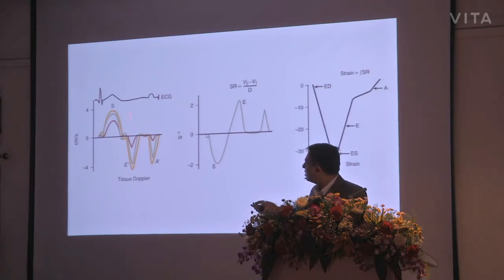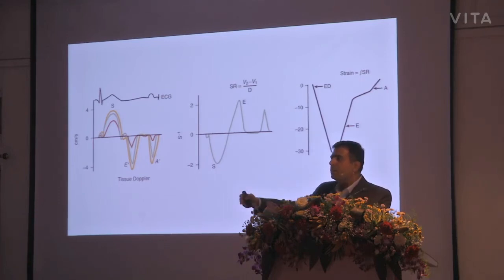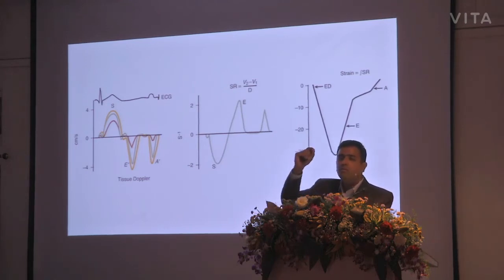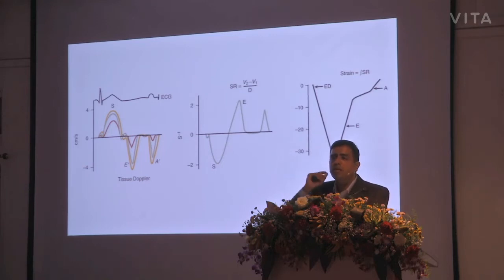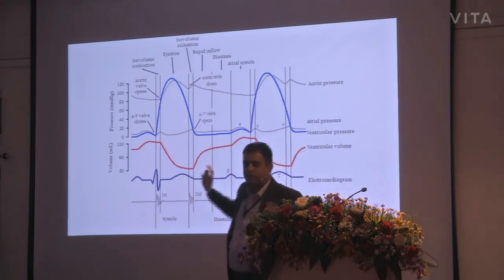The first one, the S curve is positive over here, the S curve is negative, so the systolic curve and the diastolic curves are negative where the others are positive. The strain curve, however, is a lot simpler and a lot easier for us to use. So the software in the newer echo machines will be able to do these things automatically if you put a probe, or a region of interest, in any part of the myocardium. As I told you, this talk is about this.